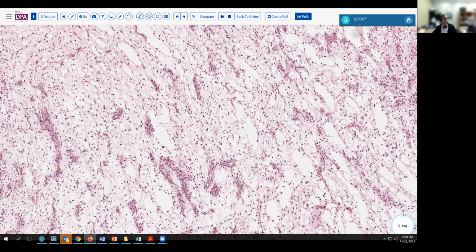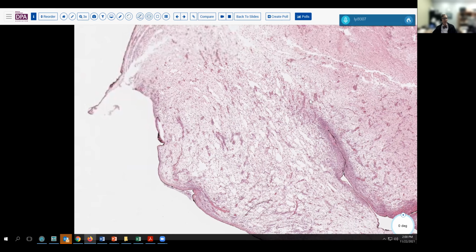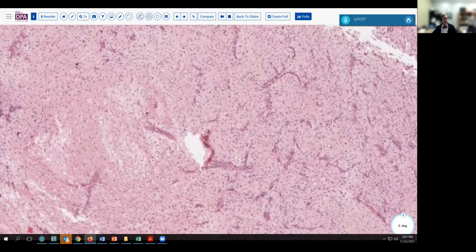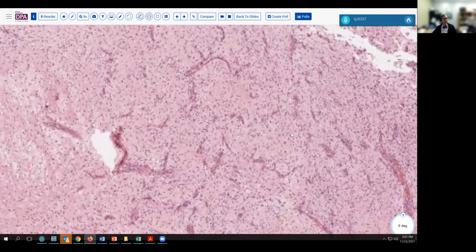Well, that in fact is what we had next door, but what do we do with this area that's more solid? It still has some branching vessels, some sort of fatty appearance, but it's lost any indication of there being fatty stroma in the tumor cells.